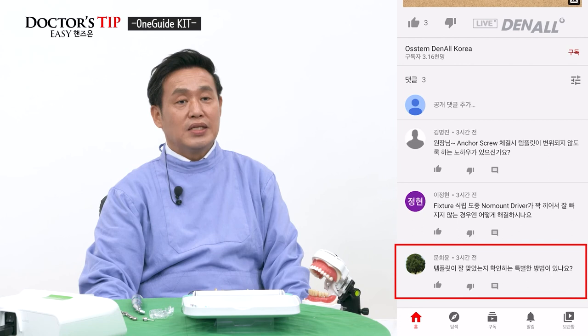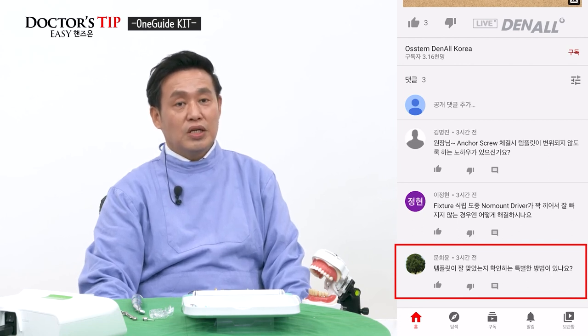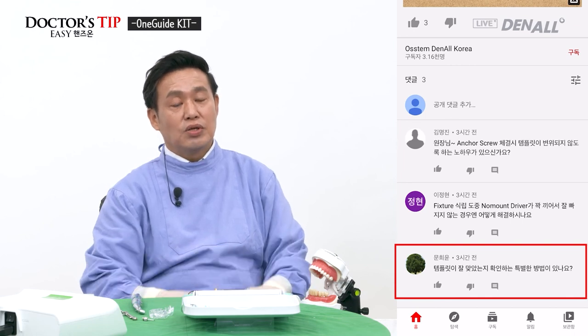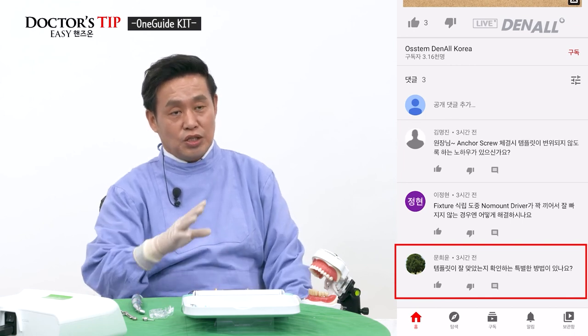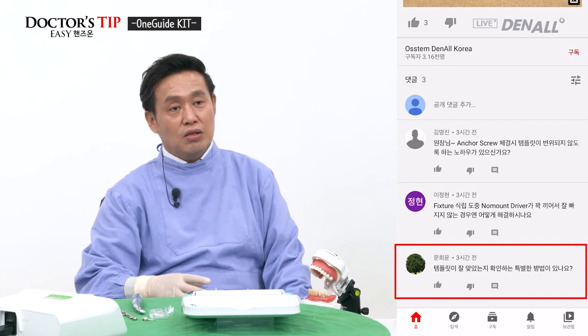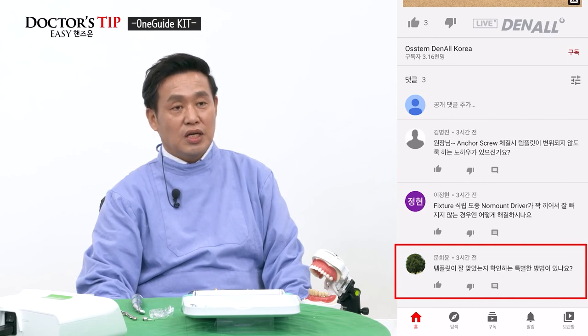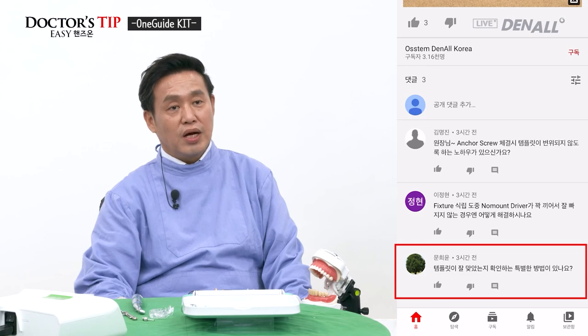Next question. How can I check whether the template is fitting correctly? When it is teeth bearing, when you receive support from the adjacent teeth, you can accurately check using the window. In the second hands-on, in edentulous cases, it's kind of difficult. In those cases, optionally, you can use CT checker that you use on the drill hole.